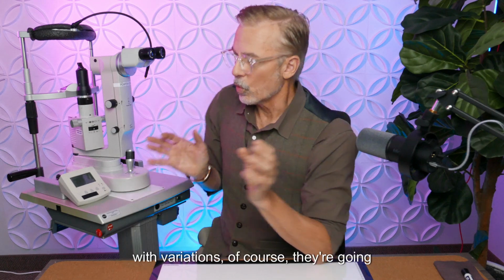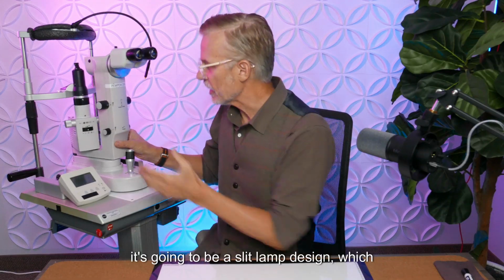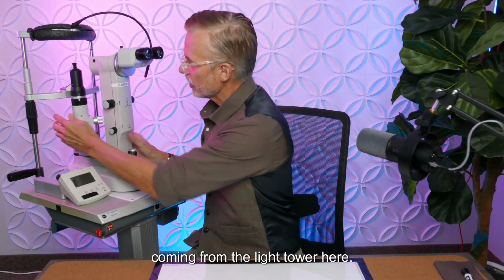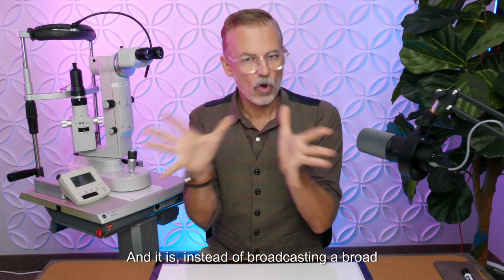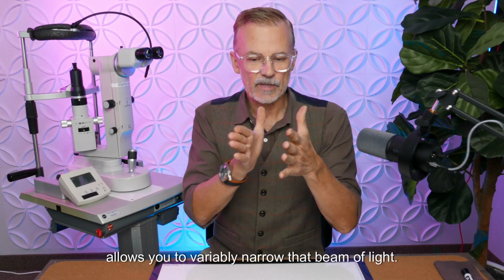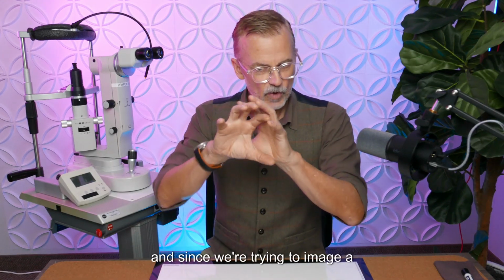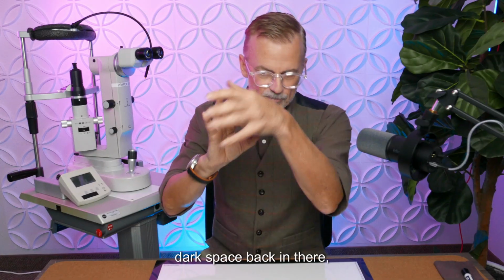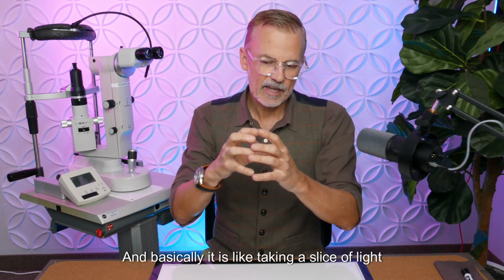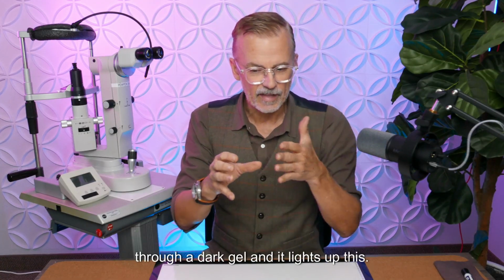So with variations, of course, you're going to have some basic controls. It's going to be a slit lamp design, which means that you have a light source coming from the light tower here. And instead of broadcasting a broad, overwhelming amount of light, it allows you to variably narrow that beam of light. You can have a wide light, you can have a narrow light, and since we're trying to image a dark space back in there, we'll take a narrow beam of light and send it through that, and basically it is like taking a slice of light through a dark gel, and it lights it up.